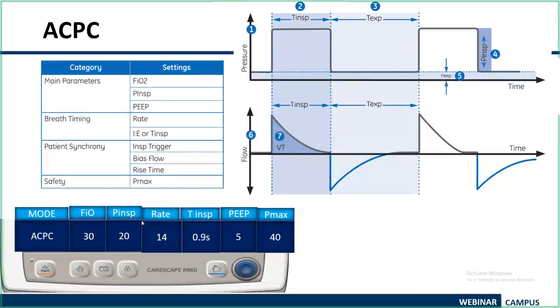Again, you should be very careful. Some ventilators will show you the total pressure control up to here. Some will show you the pressure control above PEEP. Pressure control above PEEP means that to see the plateau pressure, you have to add the pressure control to the PEEP.